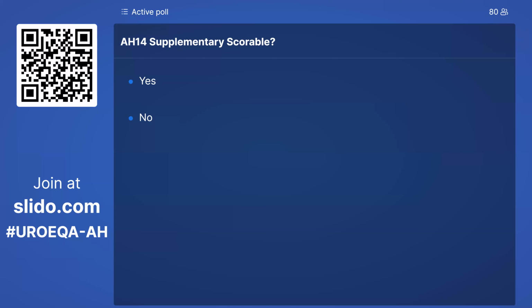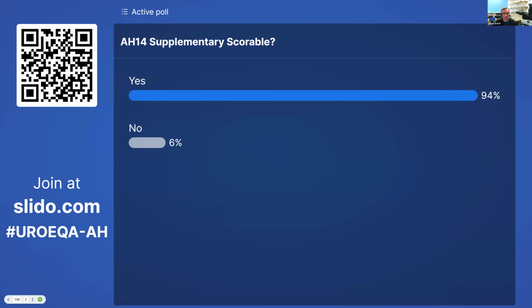We just let that one run. In case, just make sure people are happy to score the Gleason grade. We're up to the high 80s. Shall we have a look? Okay, happy with that. 94% for scoreable. Okay, so let's go on and score the grade groups.